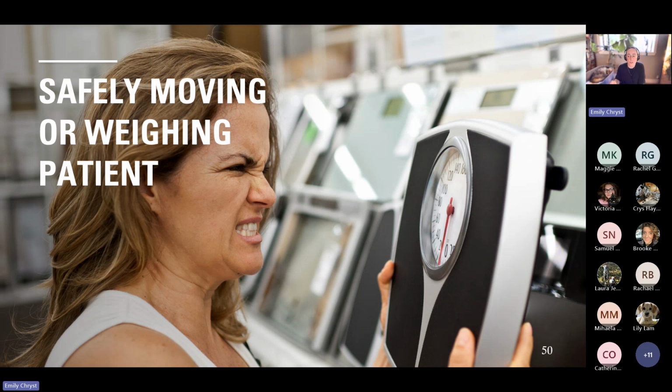And this is definitely a controlled event. So I organize all of my lines first and make sure that they are all very clearly labeled and they have a safe spot where I can really rapidly reconnect those lines when I bring the patient back. And the same goes for monitoring equipment. I make sure that everything's organized, and I'm not just disconnecting that ECG and throwing it, I'm disconnecting that ECG and clipping it in a really obvious spot.